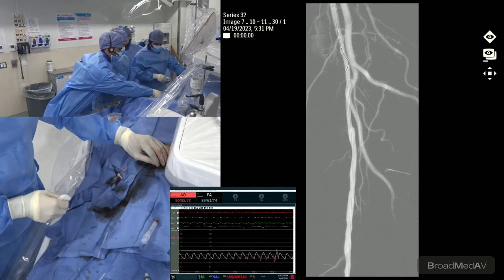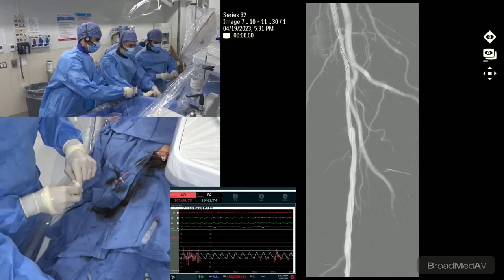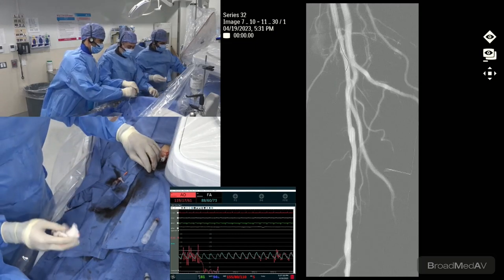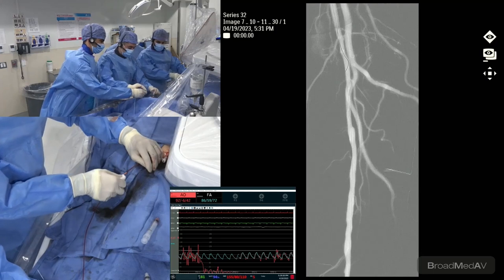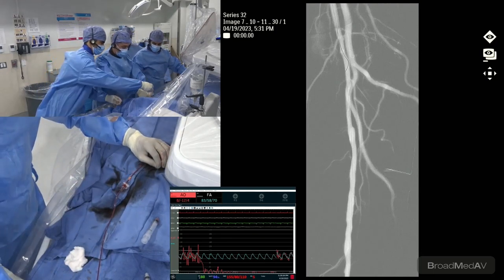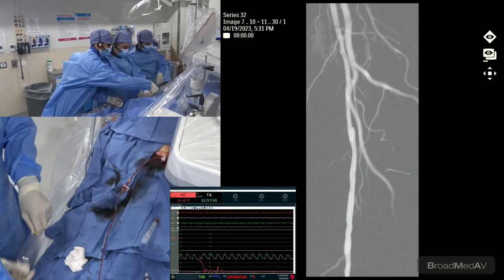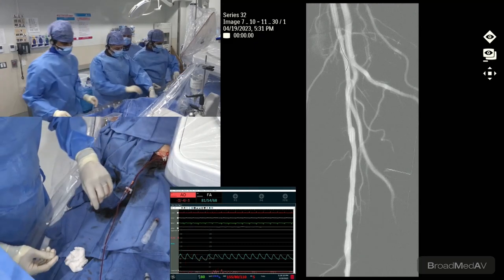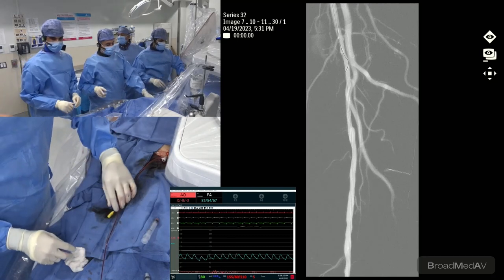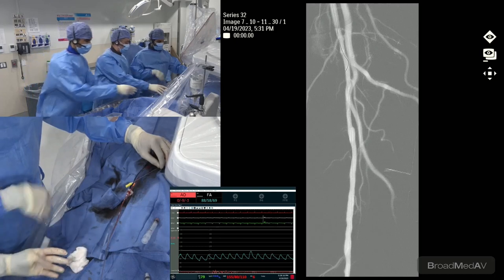Yeah, let's talk a little bit about that. That's a lot to talk about, but for the drug-coated technology, long lesions and severely calcified lesions, in almost every vascular bed, will have the highest rates of restenosis. But even despite that, even in the long lesions, we still see that even with the Zilver and the DCBs, they still have relatively good patency rates at 1 year.